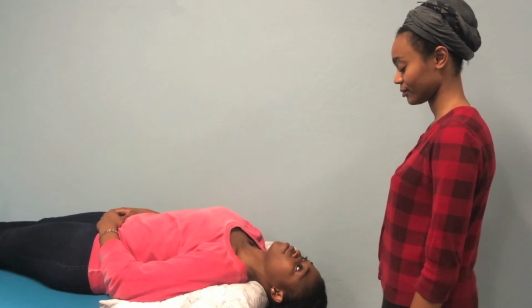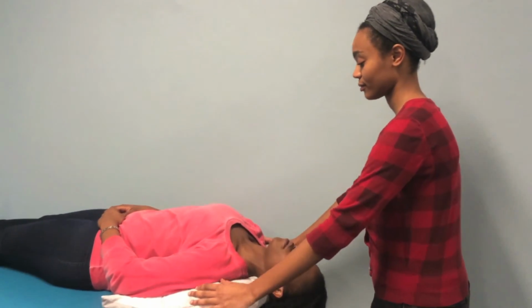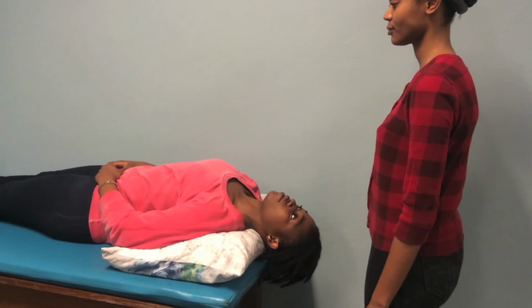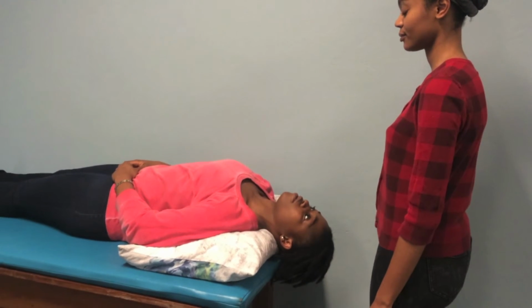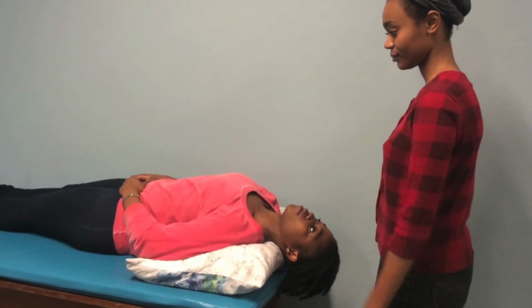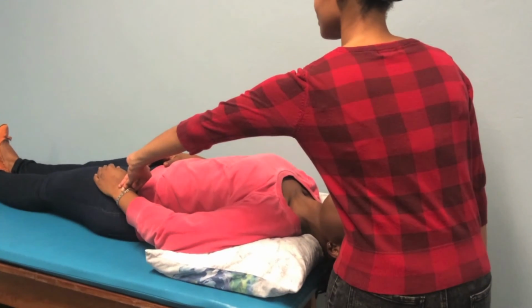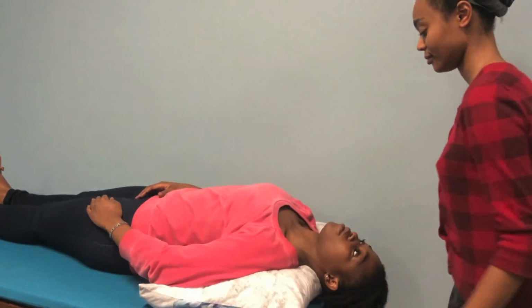The patient must be awake and cooperative. The patient is placed in a reverse Trendelenburg position with shoulder straps. Analgesia, such as morphine, is to be administered prior to commencing the procedure. Monitor cardiopulmonary function during the process to avoid hypoperfusion.